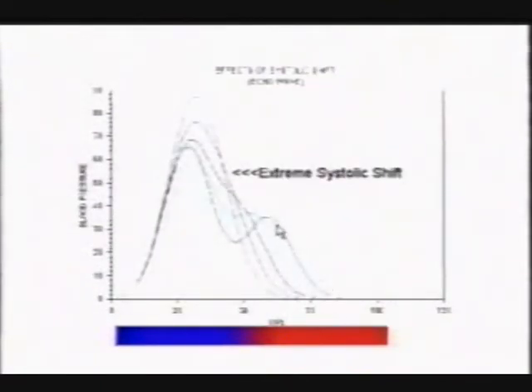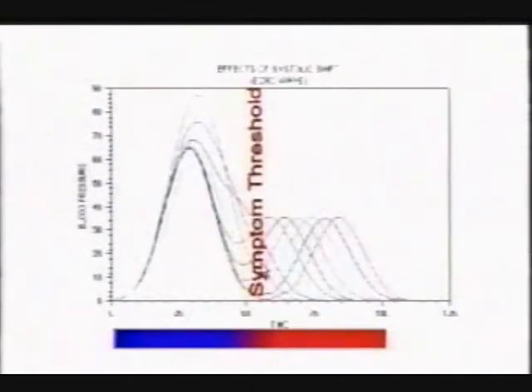In more extreme stages of systolic shift, we have further reductions in coronary flow, accompanied by an increase in systolic blood pressure as the echo wave merges almost completely with the primary wave. When the systolic shift has resulted in a large enough decrease in coronary blood flow, symptoms of coronary insufficiency appear. Further shifts may lead to heart failure due to the increased workload on the left ventricle.